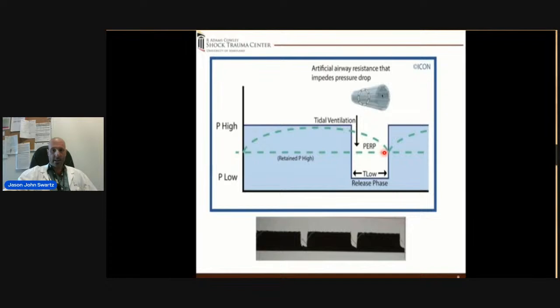And then before it can get to a really low pressure level in the lung, you're already bouncing back. This is the viscoelastic property of the lung, where you have a certain amount of energy or power being exerted and the lung follows shortly behind, and then that power is released, and the lung slowly follows behind the release of that pressure. So it's not following immediately.